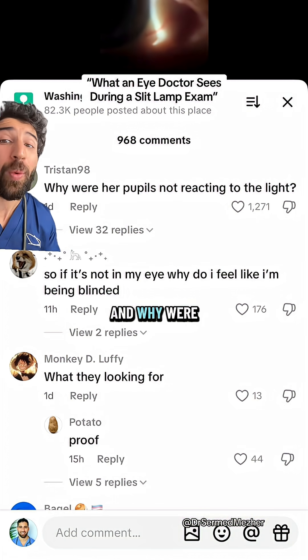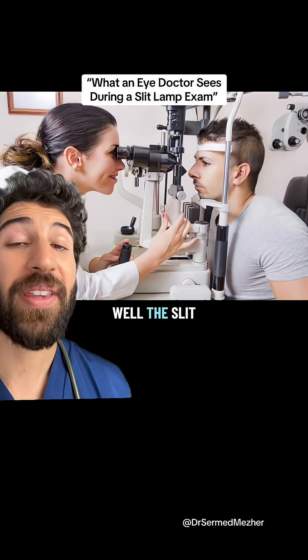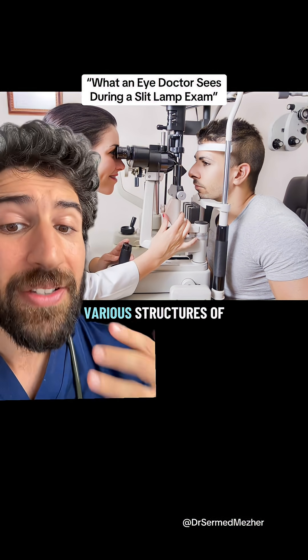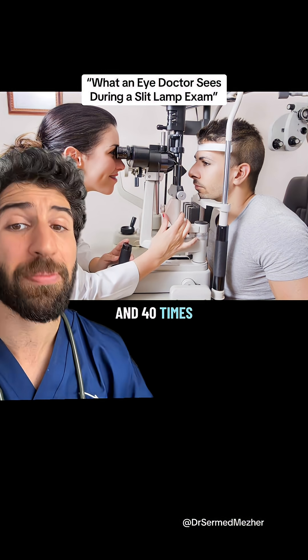What is a slit lamp used for and why were her pupils not reacting at all to the light from it? Well, the slit lamp itself is essentially a giant microscope which uses a high-intensity light source to look at various structures of the eye at between 10 and 40 times magnification.